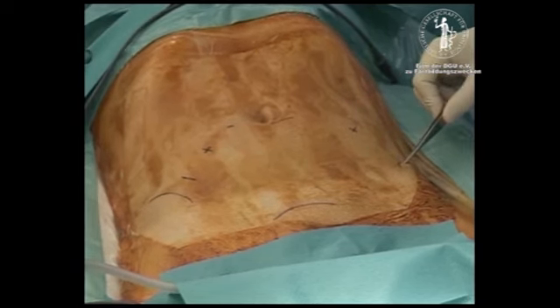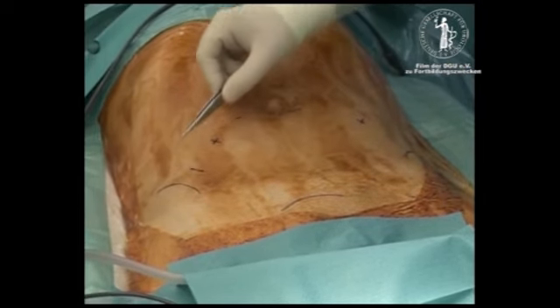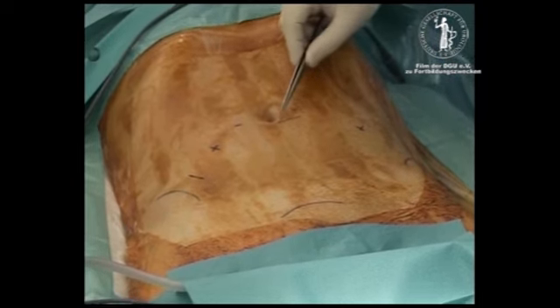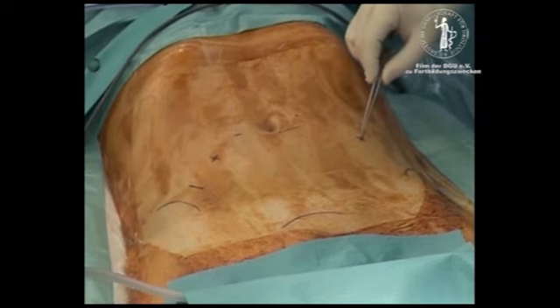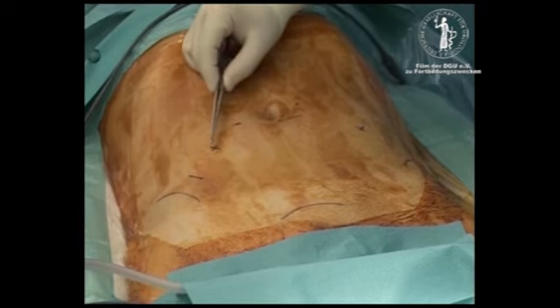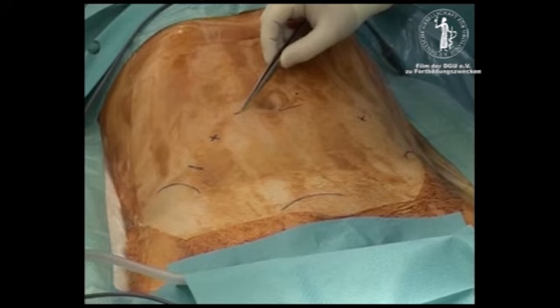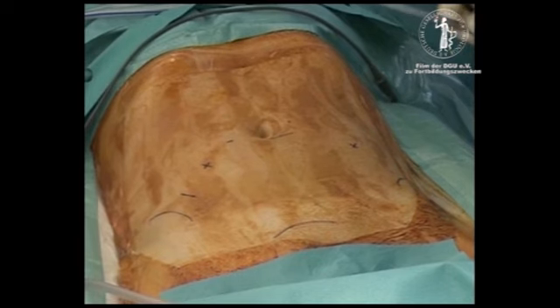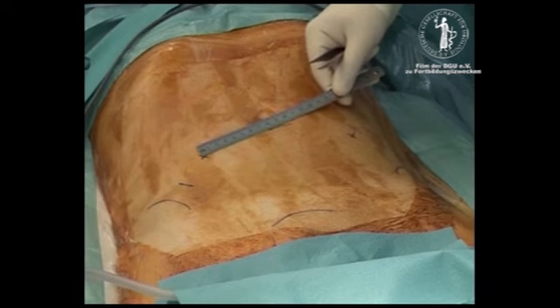The left anterior iliac crest. The symphysis pubis. The right anterior iliac crest. The camera trocar incision, left midline of the umbilicus. The left 8 mm robotic trocar at the midpoint between the camera port and the iliac crest. The right robotic trocar. The 12 mm assistant trocar craniomedial of the right iliac crest. The 5 mm assistant port is equidistant between the camera and the right robotic port. The ideal distance between the robotic ports and the camera is at least 8 cm.